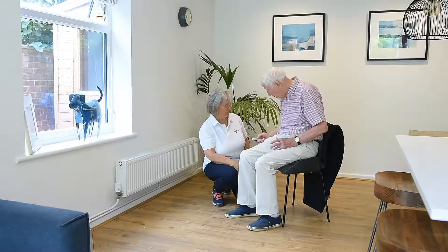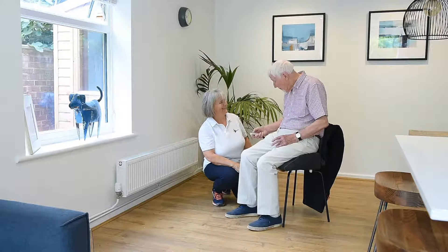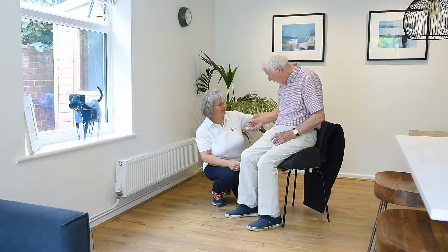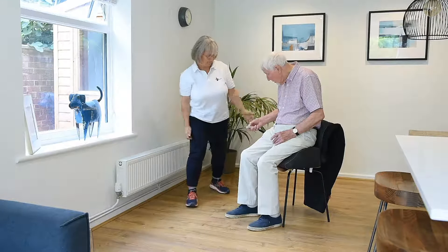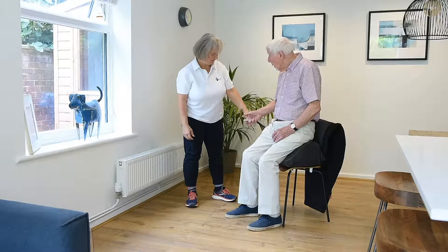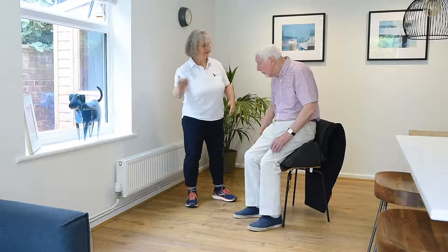The client can go up or down one cell at a time, giving them the ability to control how quickly they sit or stand, giving them the confidence to get up and walk away safely.